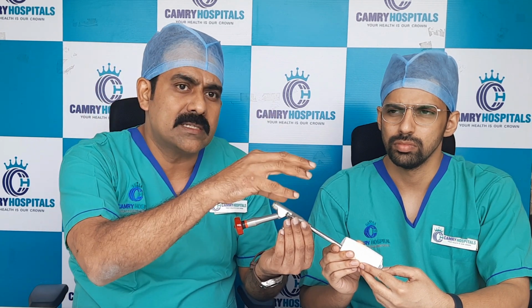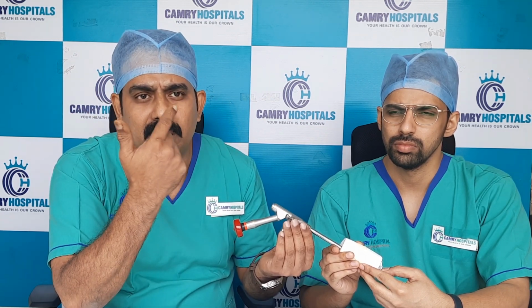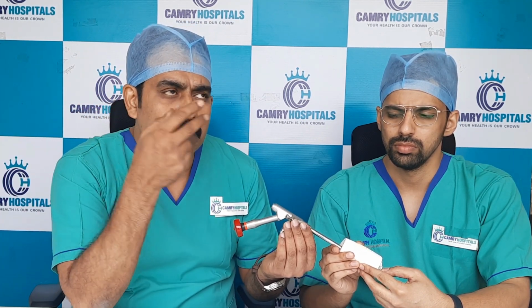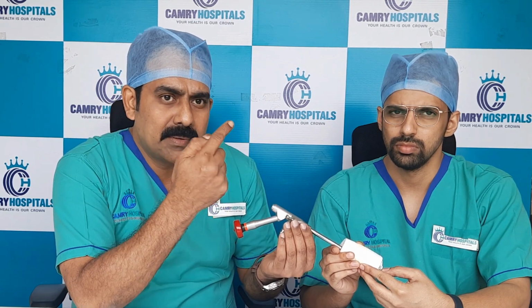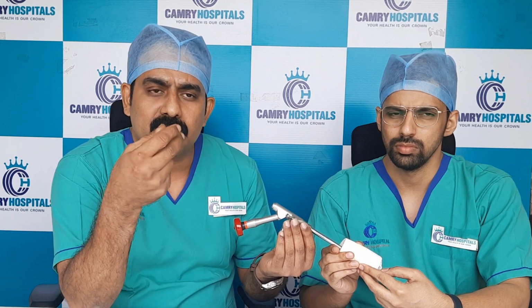We don't just go inside and blindly remove the tissues. We talk to the patients, we palpate the tissues which are causing pain. When the pain comes, the patient tells us, sir, this is the pain I had before, it comes in the leg. Then we know which tissues are the problem, and we take only that, using RF and other instruments to remove it.